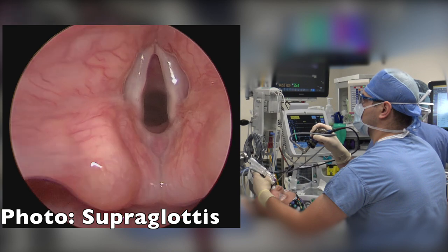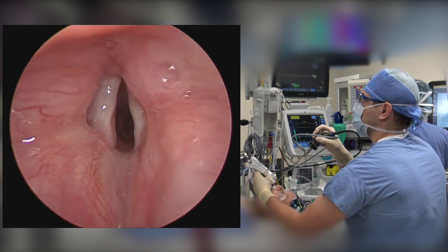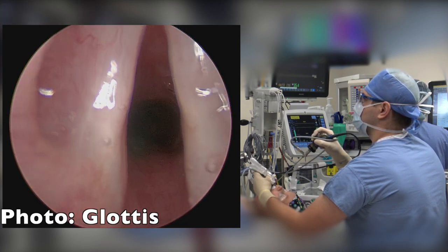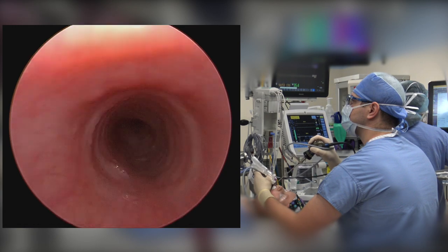We take standardized photos along the way of the soft palate and tonsils, the supraglottis, the glottis, the subglottis, as well as the upper and lower trachea.